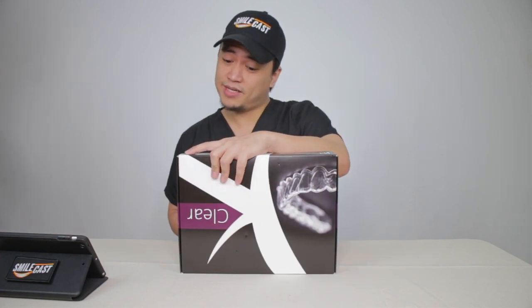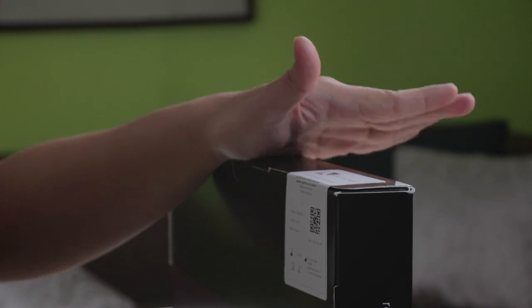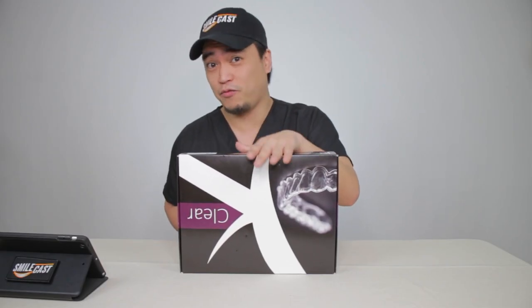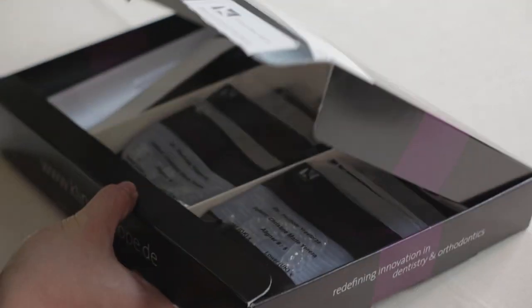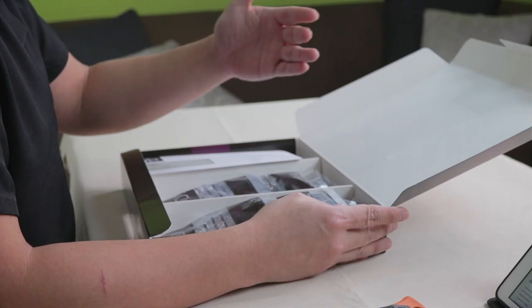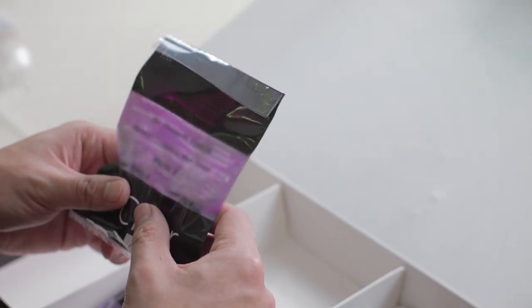Here on the tab, it says custom-made device based on patient-specific prescriptions. So clearly, this was made for a specific patient with specific goals and treatment options in mind. Let's open them, shall we? We have the aligners. There's numbers and, of course, the patient name and the name of the doctor doing the treatment. They're labeled pretty well.